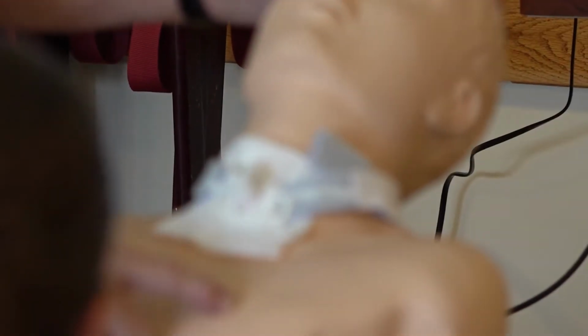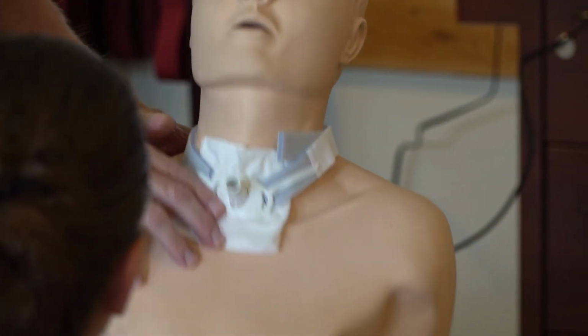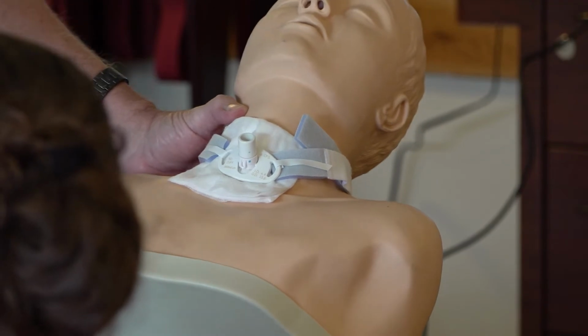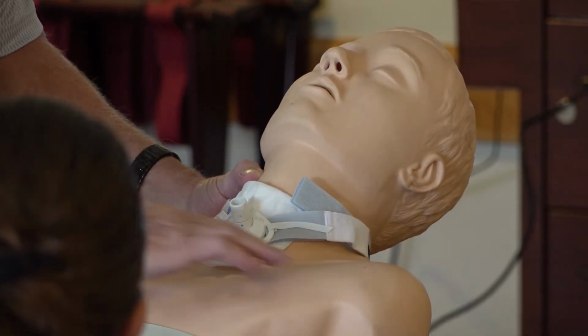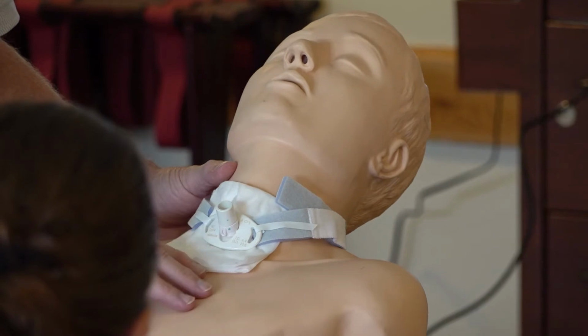I'm going to move my trach collar down to where if I need to put it back up on him, I can just go like that. I'm not going to take it off and set it over here, okay? So I have it where I have access to. Some of these trach cleaning kits, trach care kits have the cloth or drape, whatever you call it, that you can put across them. I typically don't, but some do. You can place that across them.